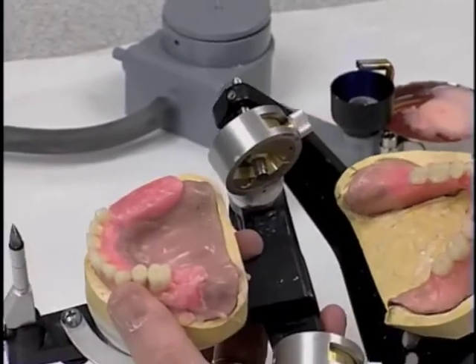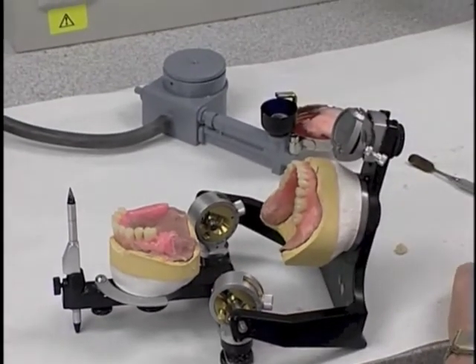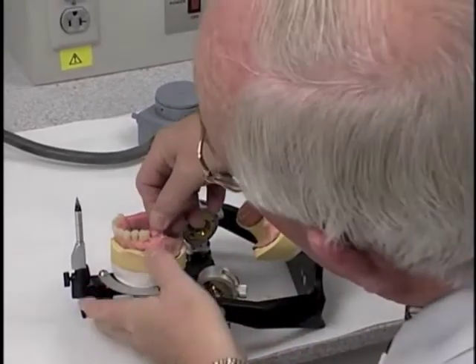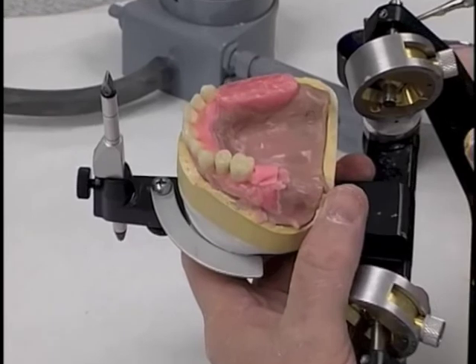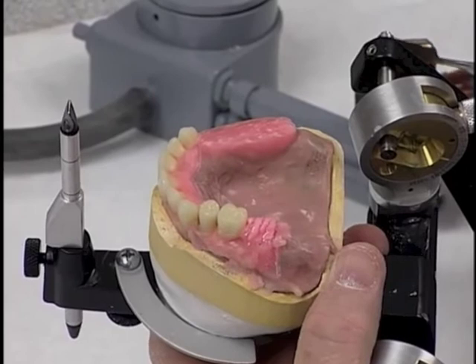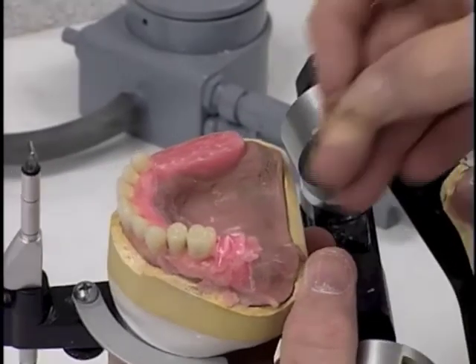And I don't like the way that occludes, so I need to remove that wax, add a little more wax to it because we don't have enough wax to support the tooth, is what the problem is. So we'll get a little more wax on it. Put a wedge of wax in this time and soften that so that that molar will go in there and be held firmly in place. Okay, we pull the wax now.